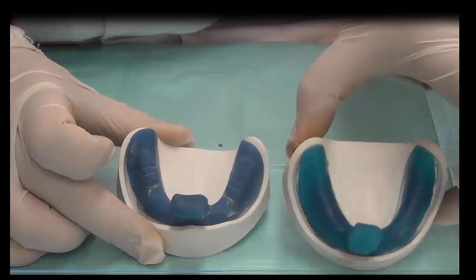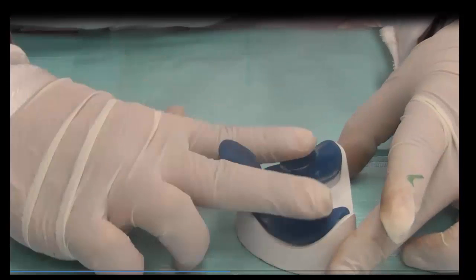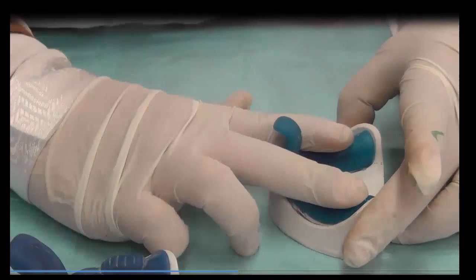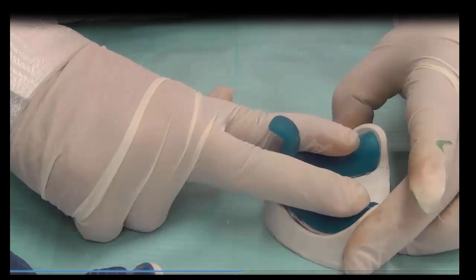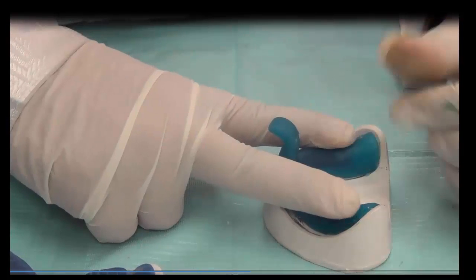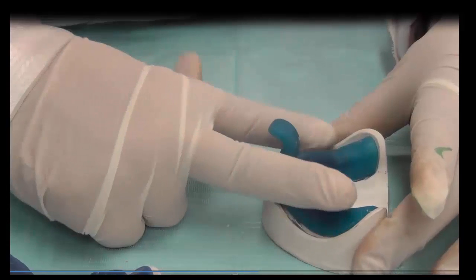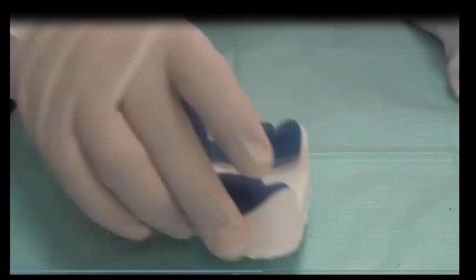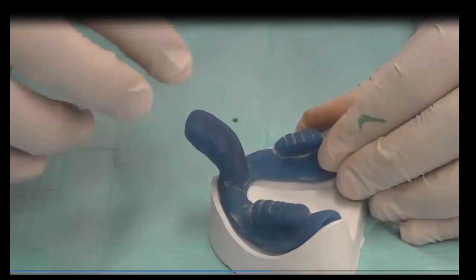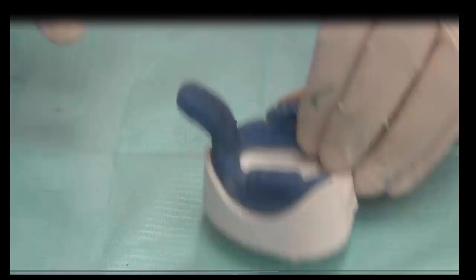And some trays have this following feature, which is called finger rest. You remember while we were taking impressions in the lower, we told you to maintain pressure on the impression material all the way, all the time. Sometimes with the presence of saliva inside the patient's mouth, saliva will let our fingers slip, and it will be difficult to hold. So we could add what we call finger rest, and these are just like extensions of acrylic on which we rest our fingers while taking the impression. These are called finger rests.